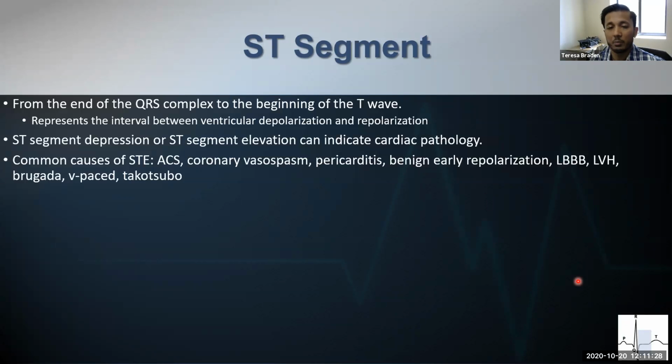I have a few slides on that because it is probably becoming like the fibromyalgia of our ST segments, where if we don't know what's going on, we're like, oh, it's probably just J point elevation, or maybe it's just benign early repolarization, but we shouldn't jump to it. It's clearly a rule out, right? And then I'll talk about Brugada because the boards do like to talk about it. You're probably going to have at most one question just on Brugada. That's pretty much localized to the cardiologist and their specific boards.